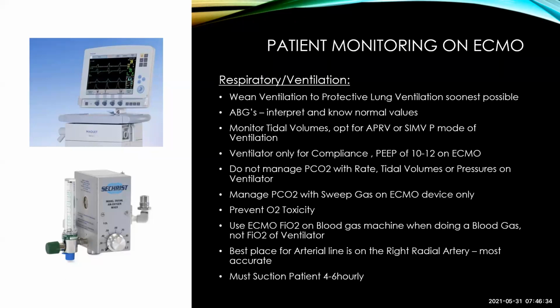If you see it shrinking slowly, say for instance, you started off with 300 and now it's somewhere between 70 and 60 over a day or so, it means your compliance is not there anymore. And then your patient's actually developing fibrotic lung disease. So as good as all of this is, we can also cause a lot of damage.